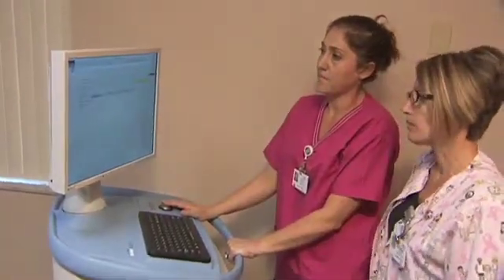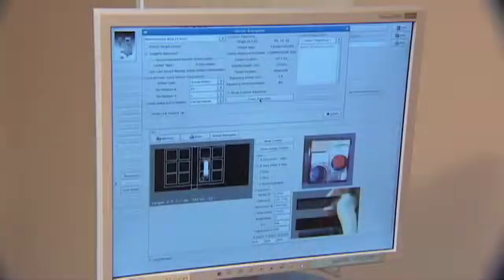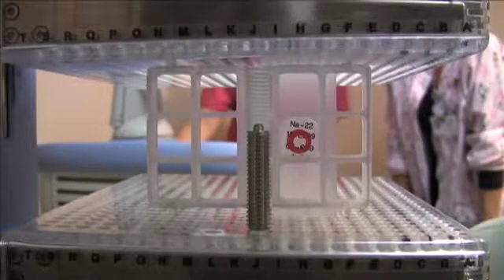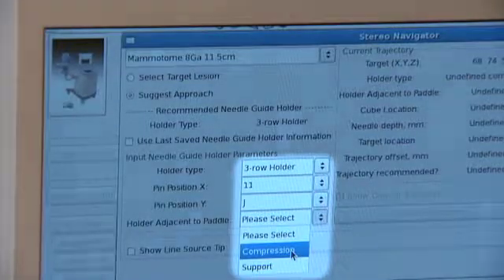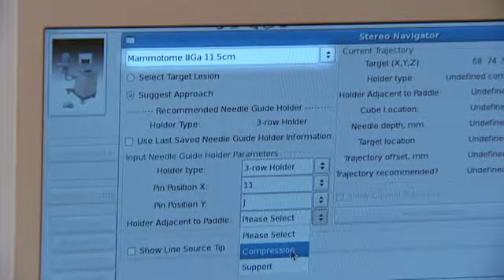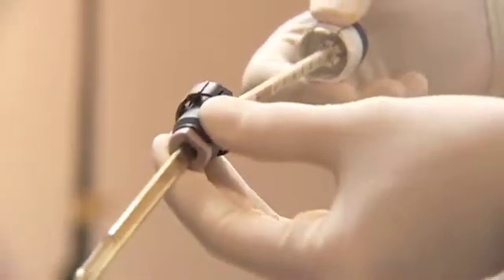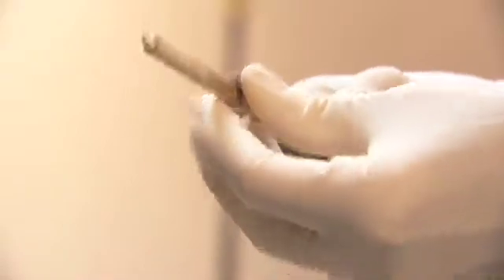An operator uses the StereoNavigator targeting software to indicate where to install the needle guide holder between the paddles. The software also calculates the distance to the lesion based on the planned needle trajectory and suggests the appropriate needle guide holder size for the given breast compression distance. Based on this information, preset the support screw in the recommended needle guide holder. Presetting the support screw minimizes the number of rotations required to mount the needle guide holder. The paddles have numbered holes; the StereoNavigator targeting software specifies in which holes to install the needle guide holder. Select the biopsy tool from the software menu; the StereoNavigator software determines the three-dimensional X, Y, and Z coordinates. Set the Z-depth of the targeting set with the indicator on the distal or patient side of the Z-Lock. Turn the Z-Lock clockwise one quarter turn to set the Z-depth. Turn counterclockwise to adjust or remove the Z-Lock, then set aside.